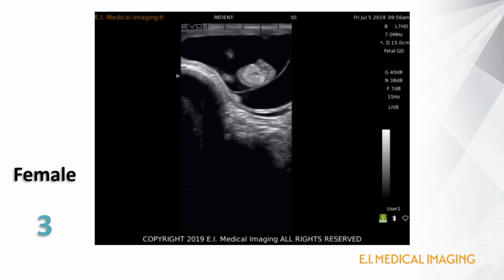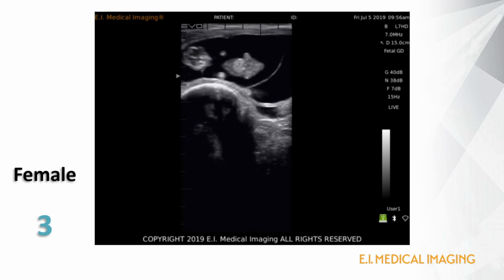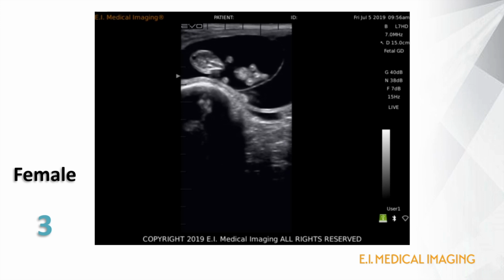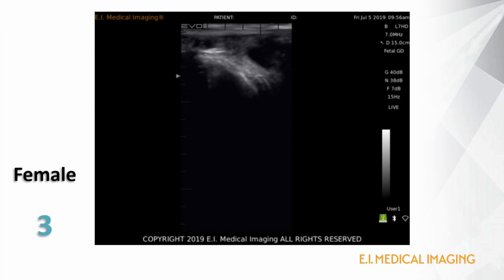There is less fetal skeleton evident, and while it is a diagnostic age for gender determination, the GT may still have a little further migration to do, which illustrates that sexing is a little bit easier to do closer to 60 days.